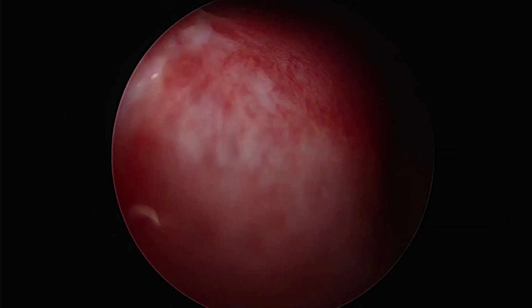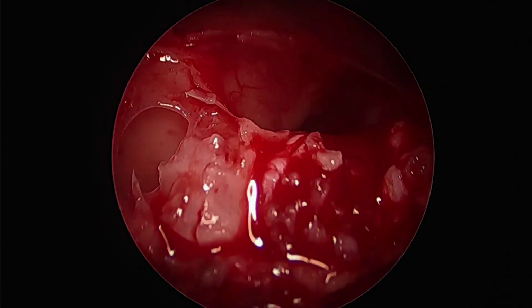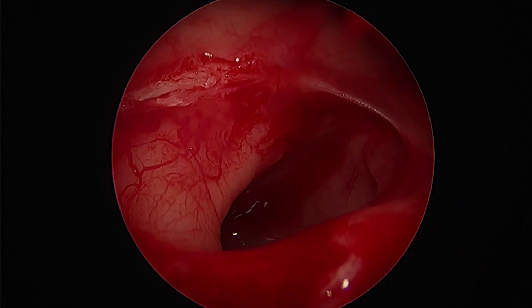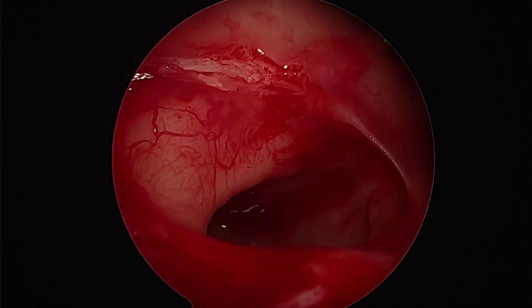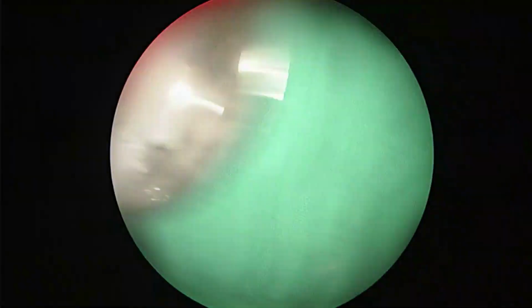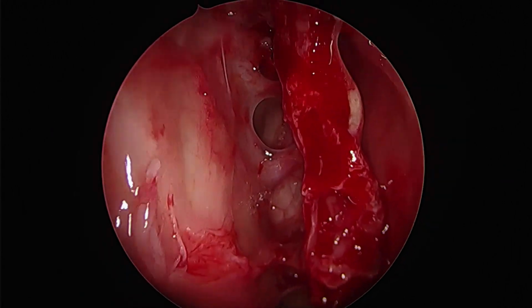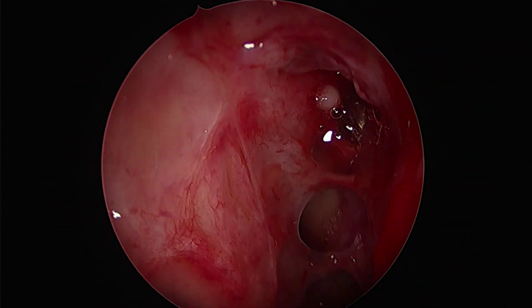Now we're using a 70-degree endoscope just for a final view. We can rotate it any which way in the maxillary sinus. It seems to be clear. This is the pterygoid recess of the sphenoid, also looks to be clear. Seems to be no unreasonable mucosa or granulation tissue here, no fungal elements. The ethmoid cavity and the frontal recess also look to be clear.